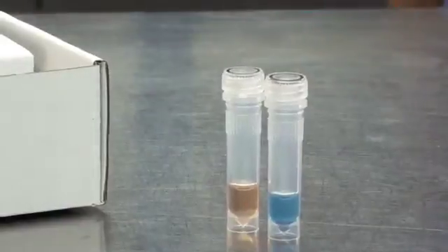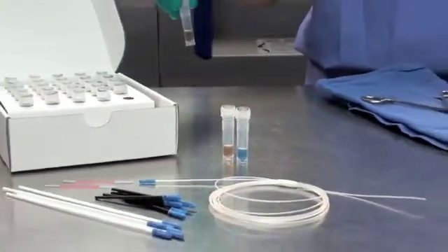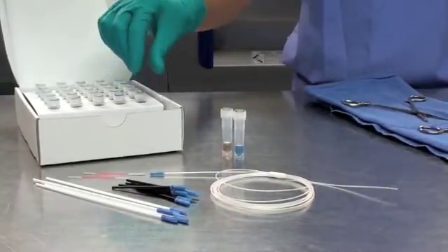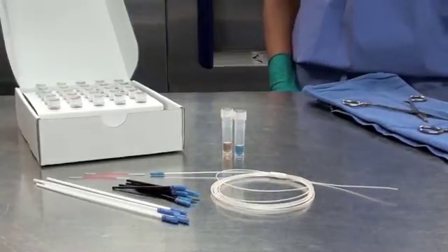The WashChex Pro is a protein test that detects residual proteins left behind on surfaces of surgical instruments, endoscopes, washer disinfectors, ultrasonic cleaners, and other metal surfaces. Protein is a significant component of bio-burden, and traces of protein indicate an unclean surface and a likely source of cross-contamination.